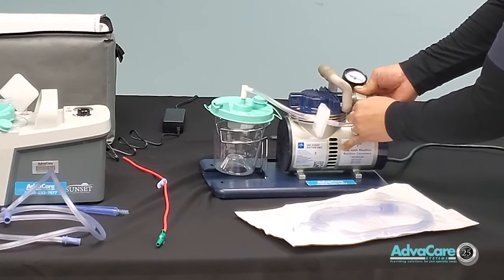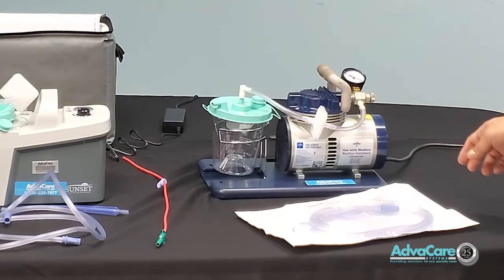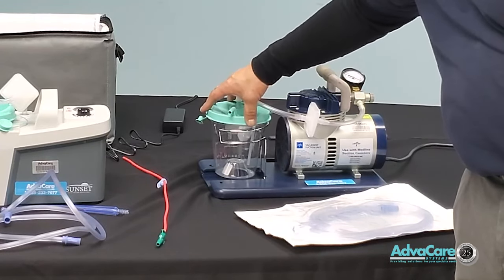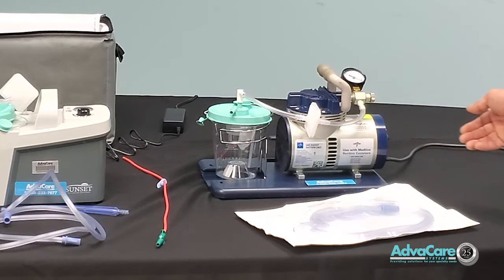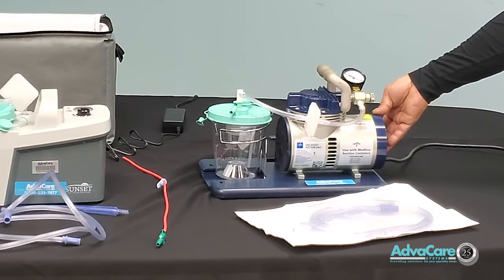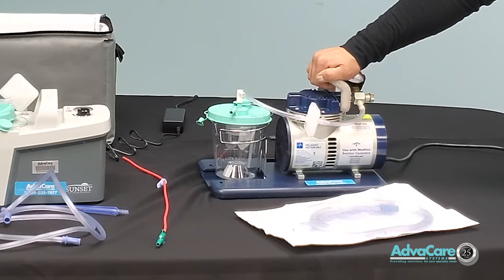When making your connections, make sure all tubings are firmly sealed and pressed on until firmly connected. Where you place the actual canister is the receptacle holder, so you can store and hold the canister as it is being filled, on the side of your machine.